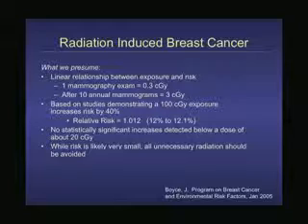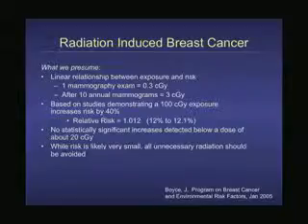After about 10 annual mammograms, that's going to be 3. And based on studies, because there haven't been any, we can't really do a study saying we're going to irradiate all these people and not these and see who develops cancer. No one's going to prove that. We can't do such a study. But if we extrapolate from what we do know with really high doses, the relative risk only increases about 1.01 after 10 years.